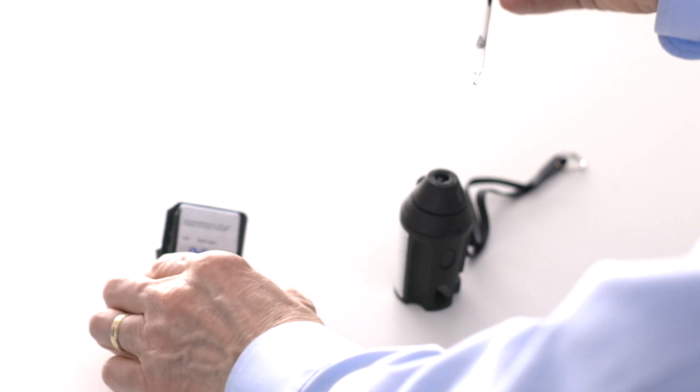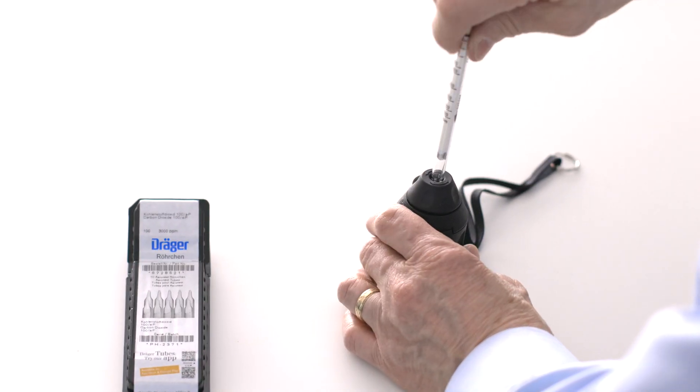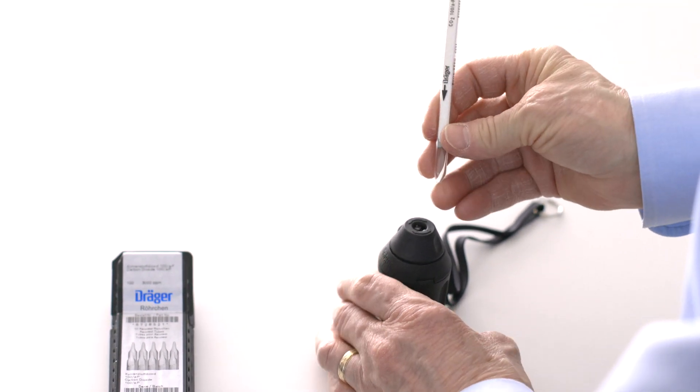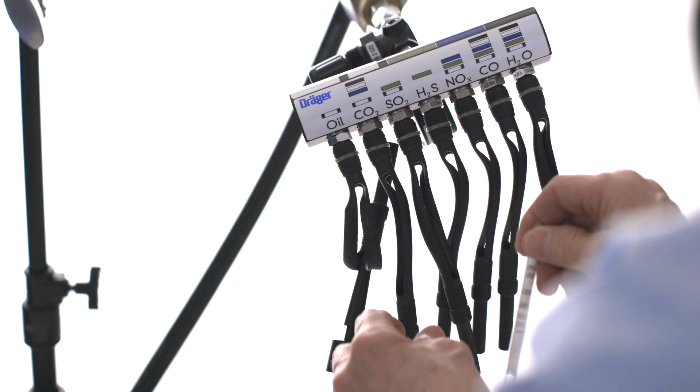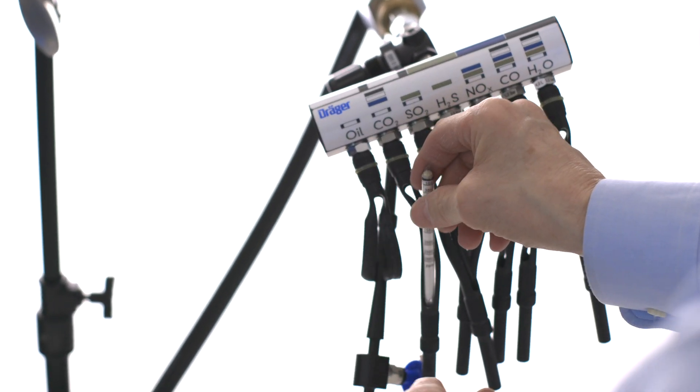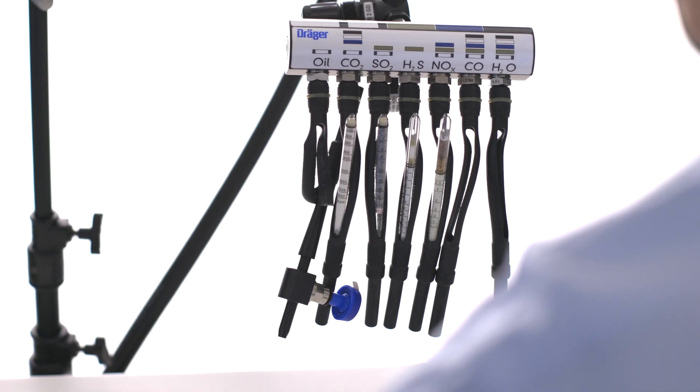Select one of the carbon dioxide tubes from the case. Score and snap off the tips using the tube opener. The arrow on the tube indicates the direction of airflow. Insert the tube into the bottom of the correct holder, leaving the top part disconnected for now. Do the same thing for the other tubes.